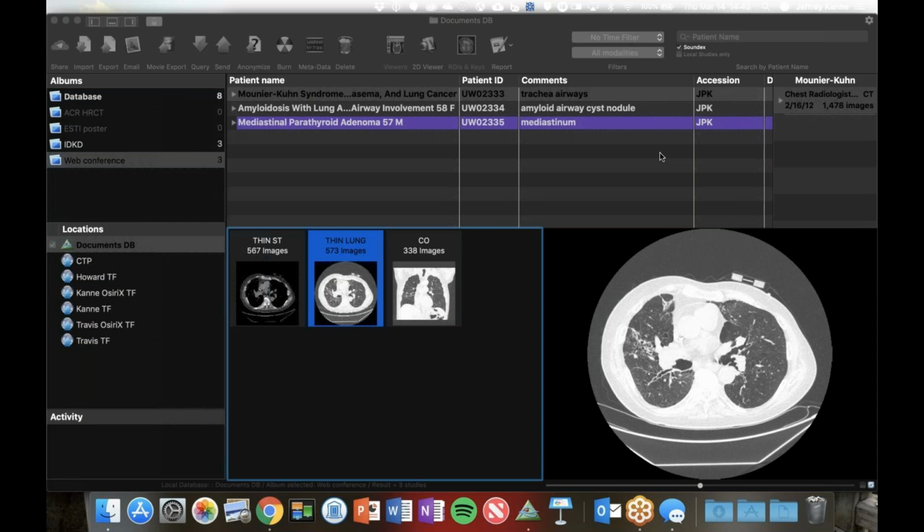Yeah, and in my readings in the past, I've come across things of deficiency of smooth muscle. There is that thin trachealis muscle, deficiency in elastic tissue, collagen deficiencies. And that's why maybe you also see the scalloping on the lateral walls, the tissue between the cartilaginous rings becomes weak. And you see that bulging or whatever, that sort of corrugated appearance.